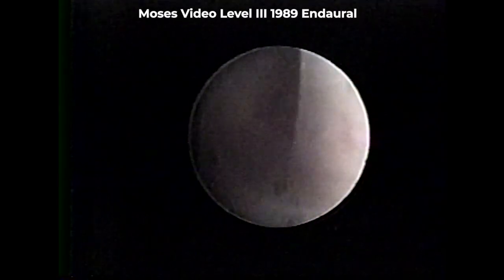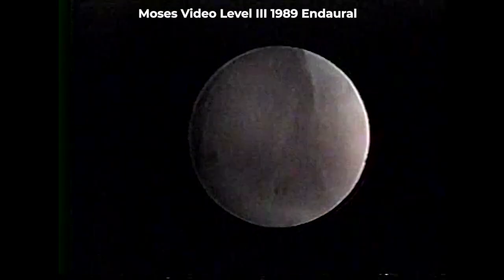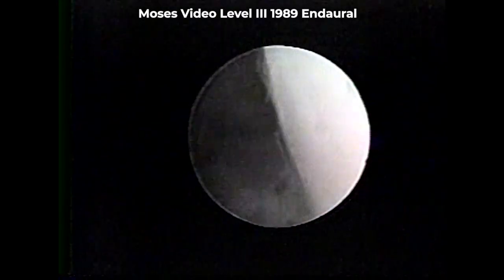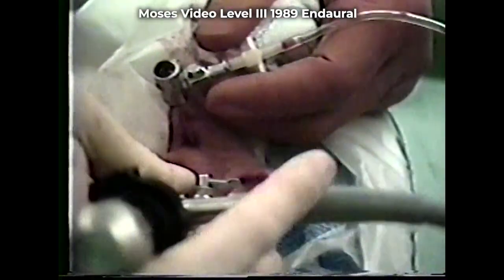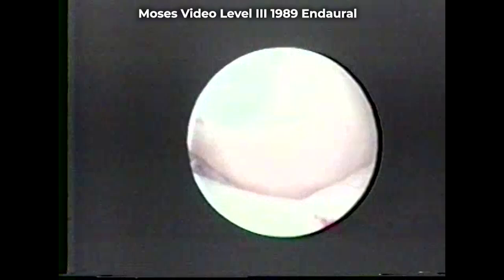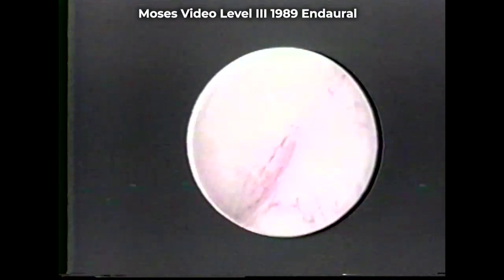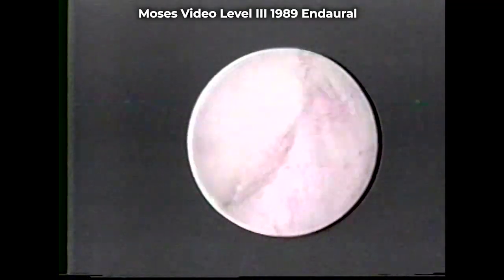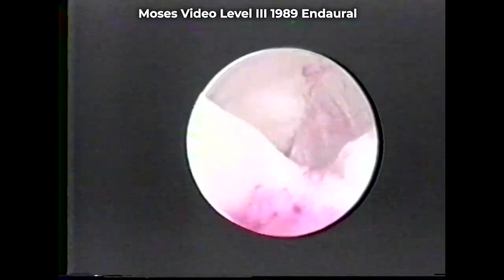Viewing through the infralaterally placed arthroscope, you will see the cannula and trocar enter the joint through the posterior wall. Initially, on endaural puncture, the posterior bilaminar zone and oblique protuberance can be readily visualized. Note how the medial trough visualization and access is facilitated.